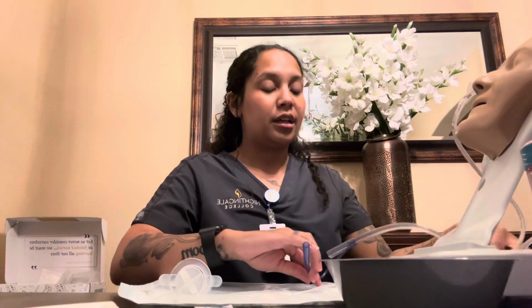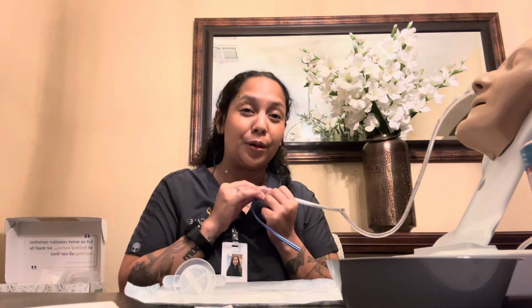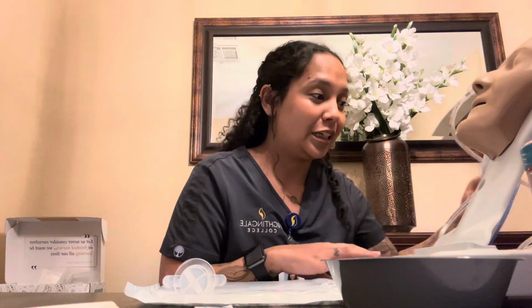All right, and then once placement is verified by the x-ray, I would then proceed with her order. So for her, the order was for the enteral feeding, so I would connect it to her feeding pump. We have kangaroo pumps at my job, so I would just connect her to that, and then we'll call it a day. Perfect. And then before I leave, I would say thank you so much for allowing me to do this procedure for you. Wash my hands, don my gloves, take off my gloves, wash my hands, and then leave the room.